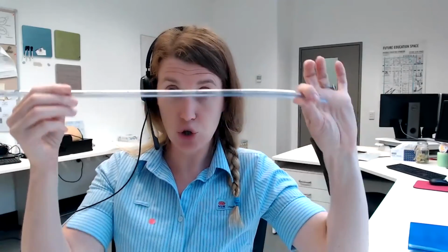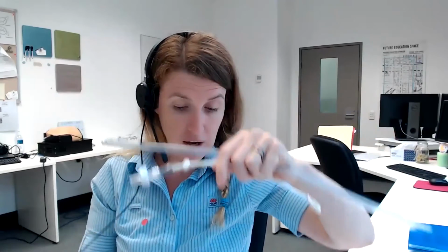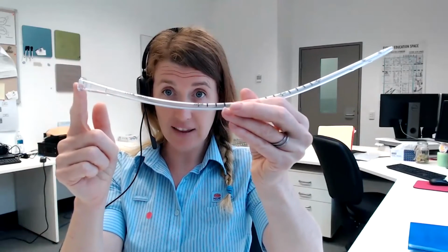Okay, so that's the drains themselves, or a variety, and they're not the only ones. It's just to give you an idea that there's a variety on the market. Some of the other kit that you might get exposed to, and again, this is site specific, different places will have different ways of setting up their catheters and drains, but essentially we're going to put a catheter into the patient. We need to connect this catheter to a drainage system. So there's a few different things you can get. This is like a connecting tube. So for example, the doctors have inserted this pigtail into the patient. This might go on the end, and then this connects to your drainage system. Or your drainage system might just connect straight to the catheter that's been inserted.